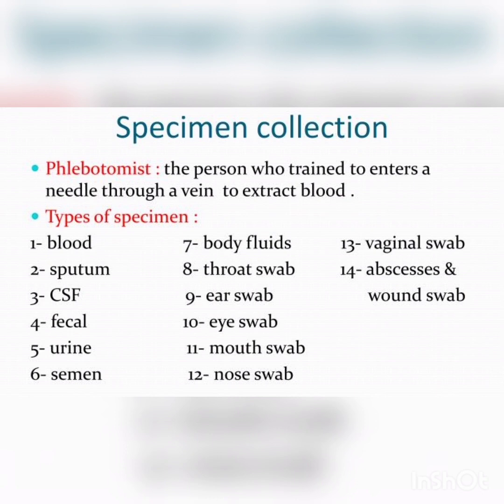It is done in a Pyrex test tube. So there will be a Pyrex test tube. The size of that test tube will be 20 into 150 mm, which is cotton plugged. There will be a plug of cotton. So it will have an applicator stick also. It is a very small test tube which contains thioglycolate broth.